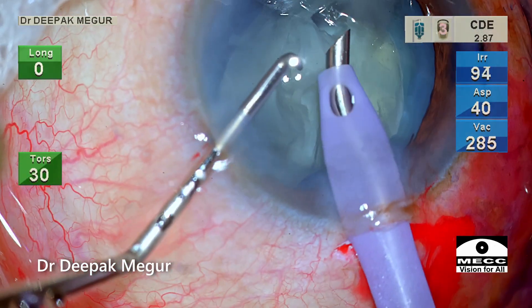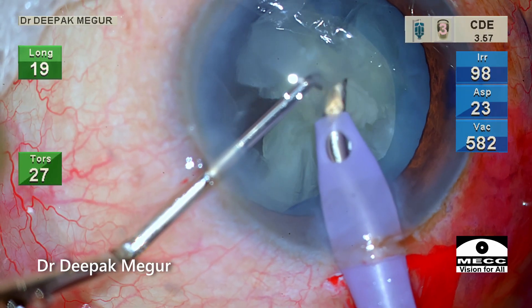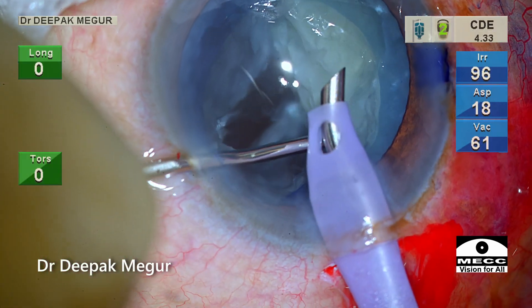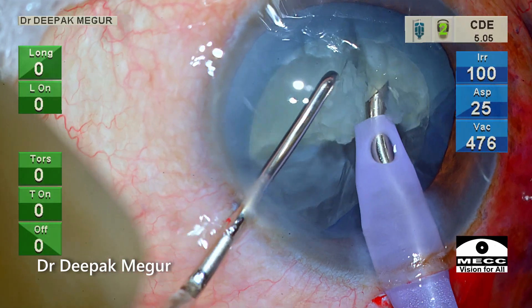The remaining two fragments of the heminucleus are pulled out of the bag and emulsification is done above the anterior capsule in the anterior chamber. Since the bag is now empty, I can rotate the nucleus safely and complete the emulsification process quite easily.